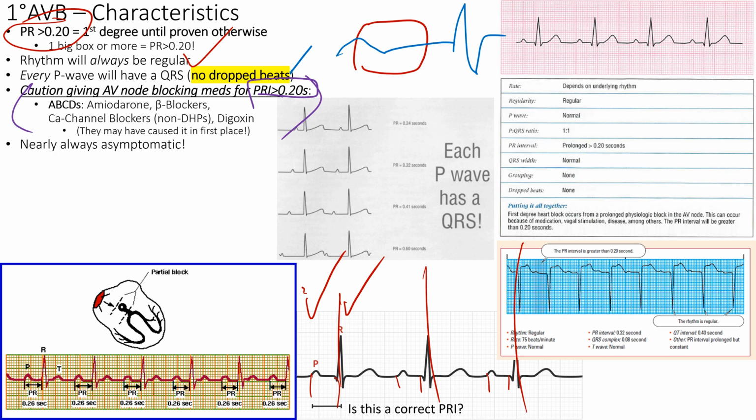So when you go to the hospital, most of your patients are on telemetry monitoring. They have EKGs in place, and we can monitor if they have a prolonged PR interval or not. That's something you should be reporting to your clinical instructors, saying my PR interval is this before I give my metoprolol, which is one of my ABCD drugs, one of my beta blockers.